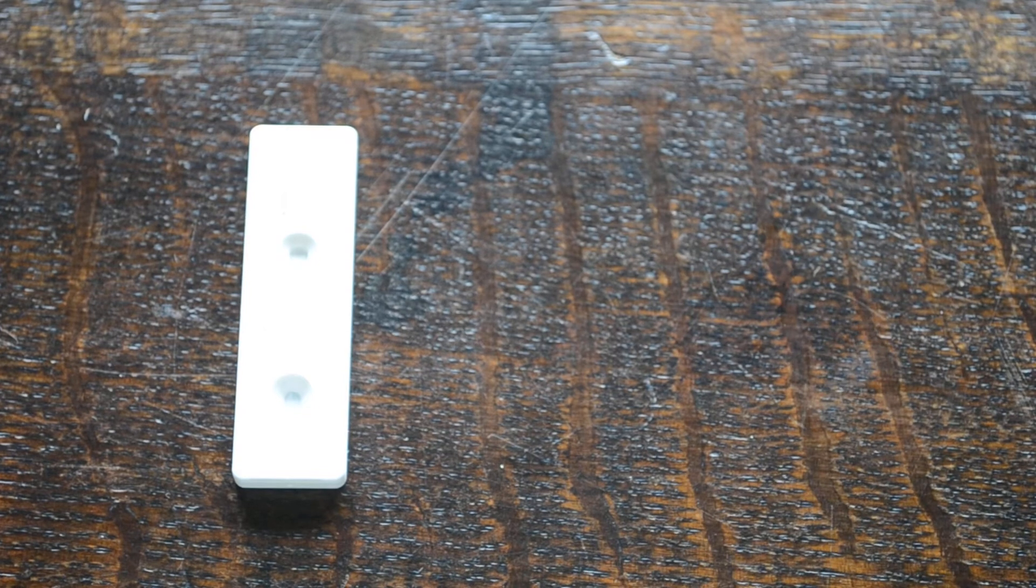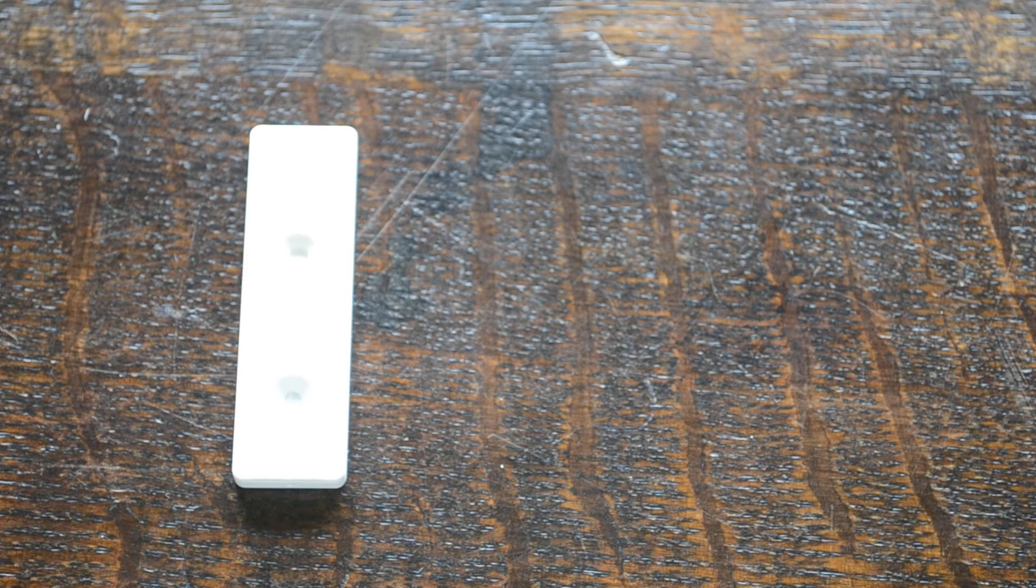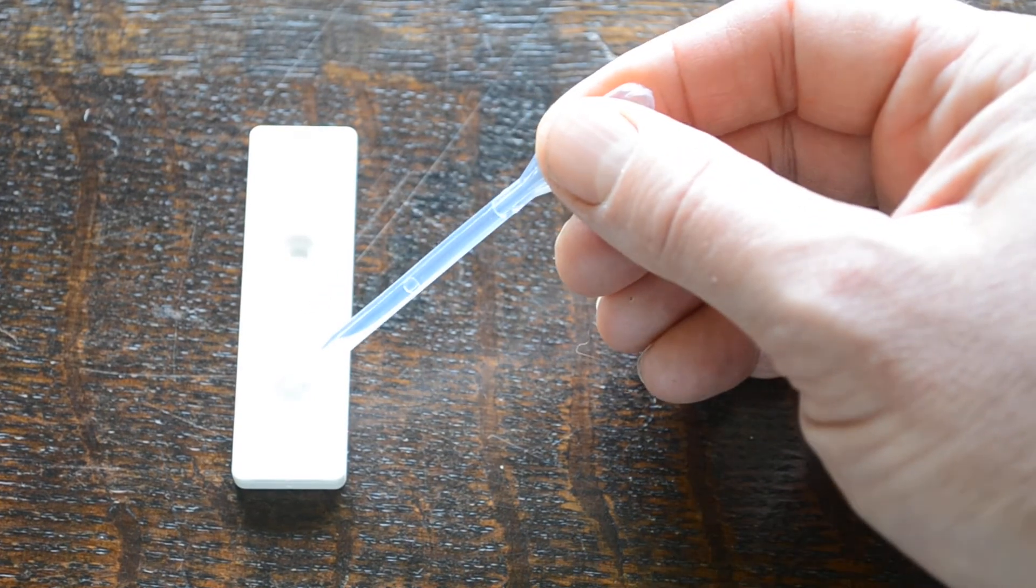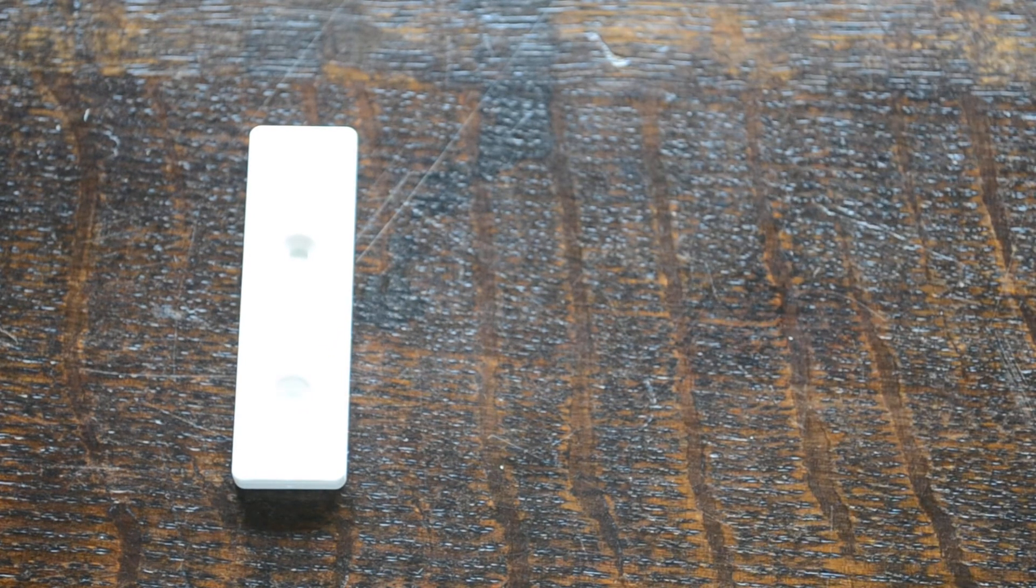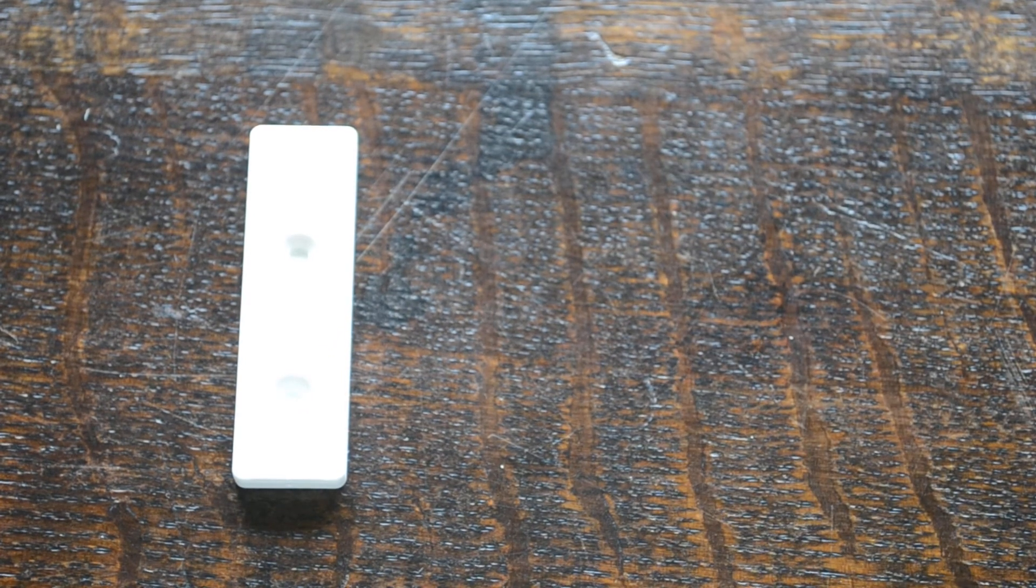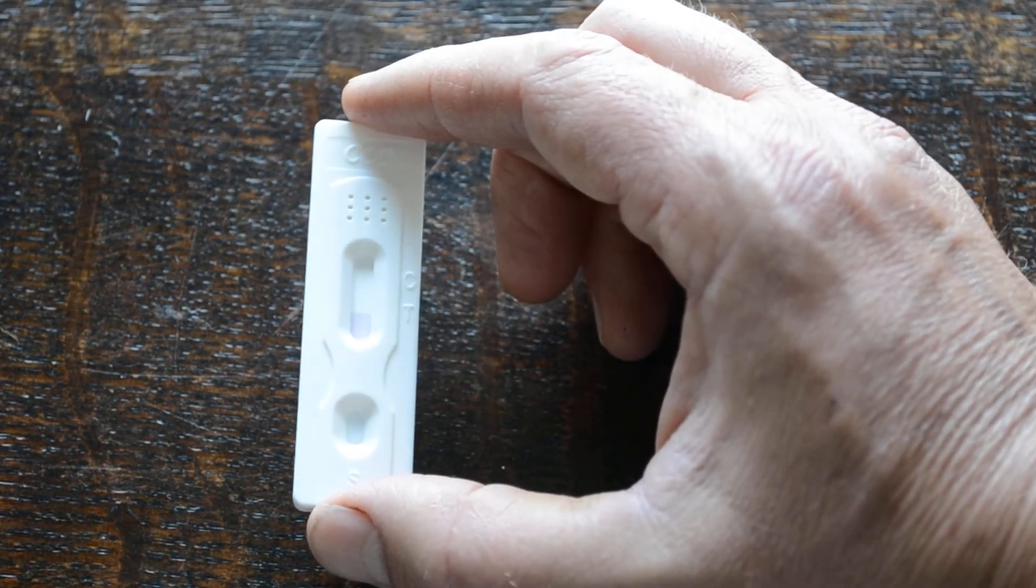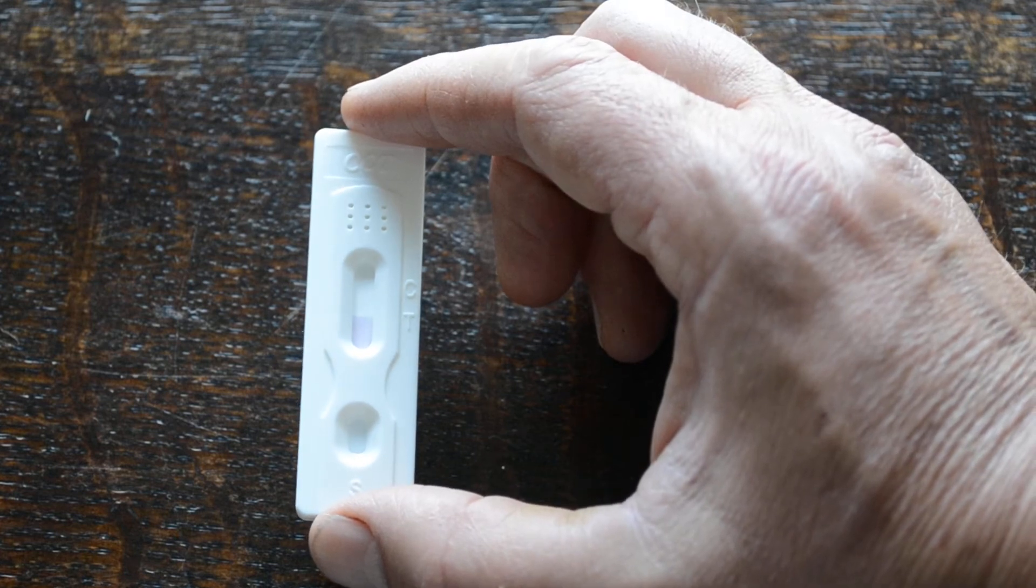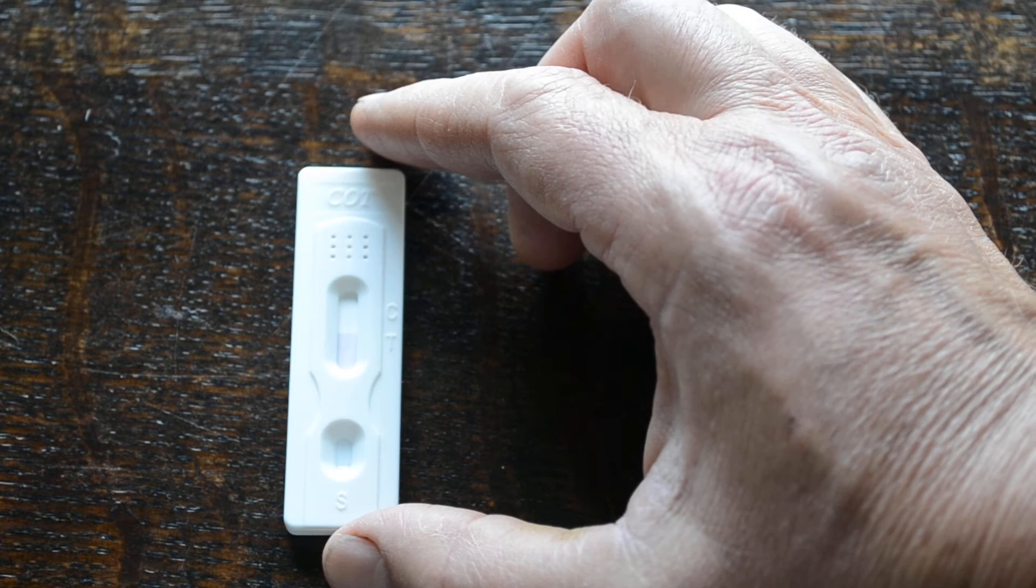So if we get a sample and apply it for you, you'll see this test membrane running. Just going to apply three drops of sample. This would normally be human urine, and then you'll see almost immediately the pinkish dye starting to run in the results window. It's osmotically absorbed up the membrane, passed through the test area and the control area.